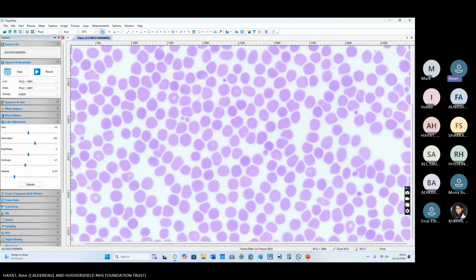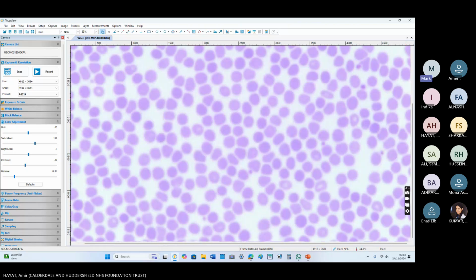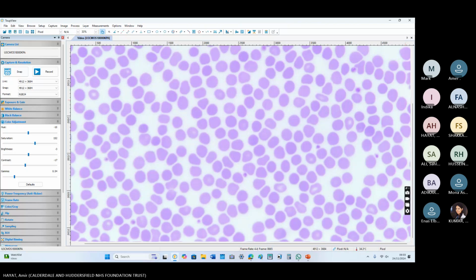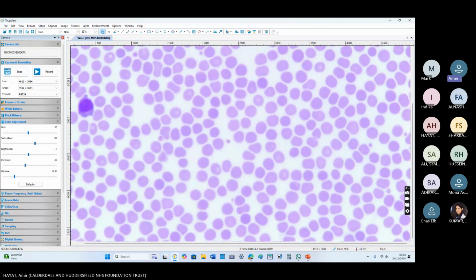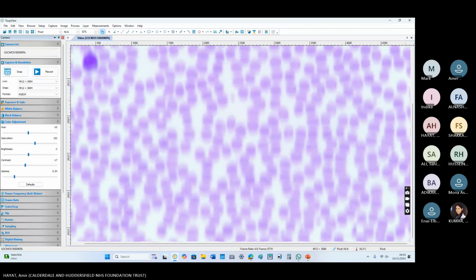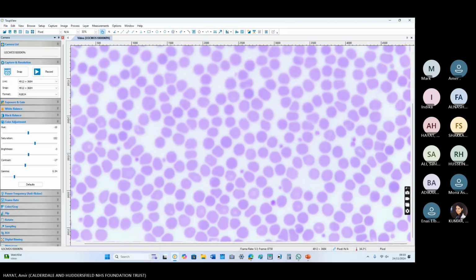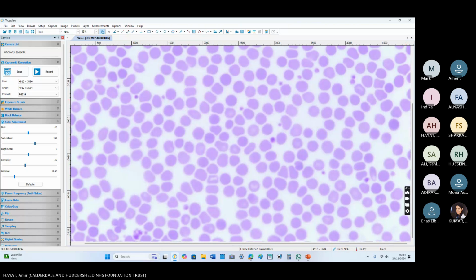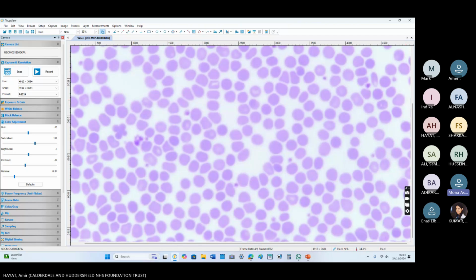So what will be the next step after seeing this blood film? I certainly requested JAK2. If I say no, I don't want to request JAK2, there is something else that you need to do. Examine the patient for splenomegaly. Why? Suggestive of myeloproliferative neoplasm.